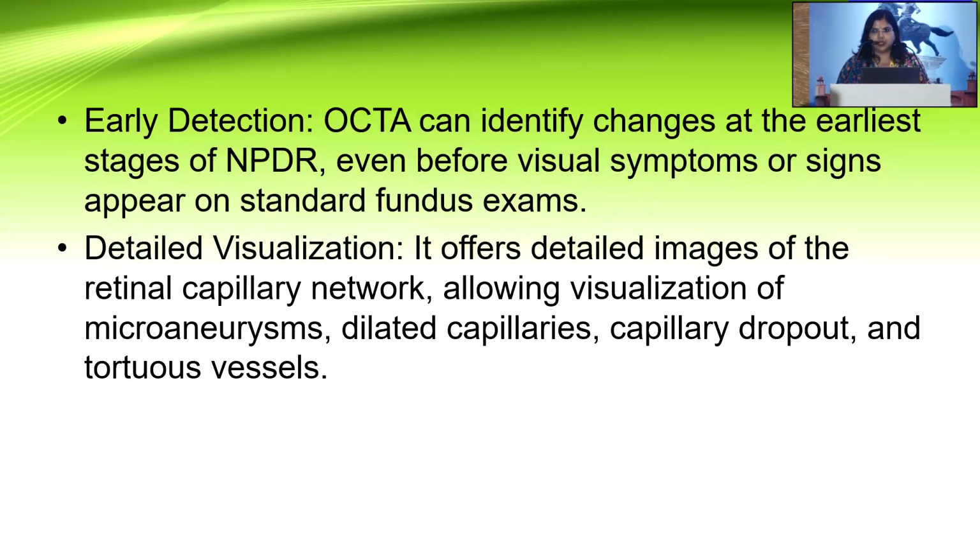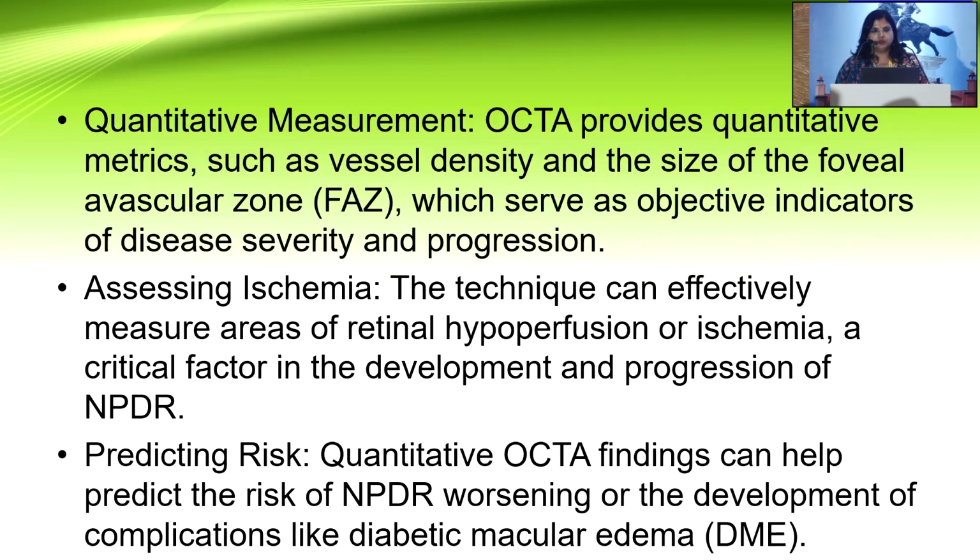It offers detailed images of retinal capillary network and allows the visualization of microaneurysms, dilated capillaries, dropouts, and the tortuous vessels, which give an idea of the disease progression. It provides quantitative metrics such as vessel density, FAZ. They act as objective indicators of disease severity and progression.